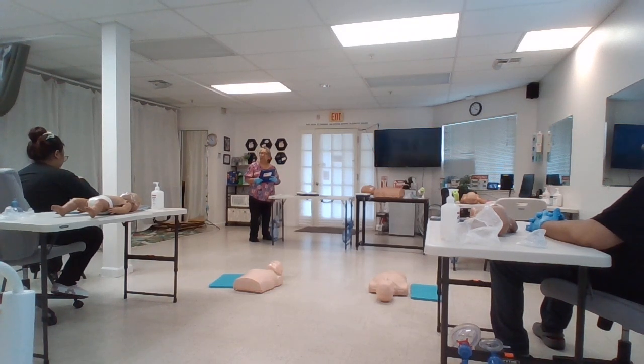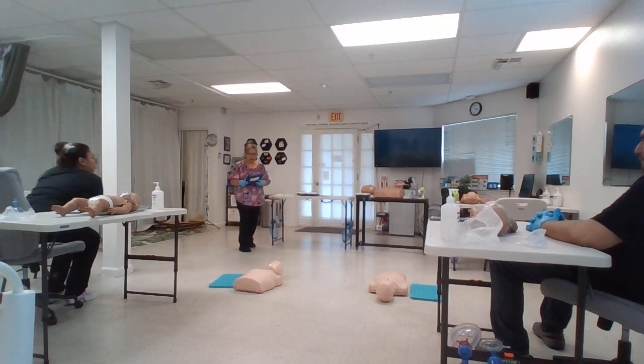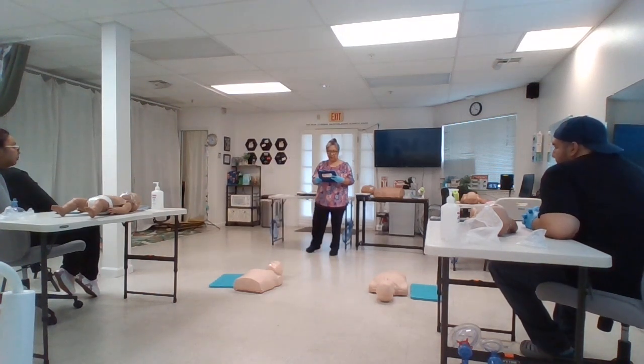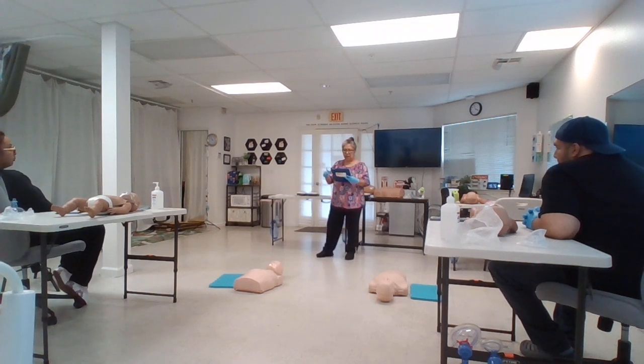Okay, you guys are ready to take your adult CPR session hands-on now, so that we can put this aside. So we'll do it one at a time. What I need to see is that you should be able to check for responsiveness, check for breathing and pulse, and activate the emergency response system.